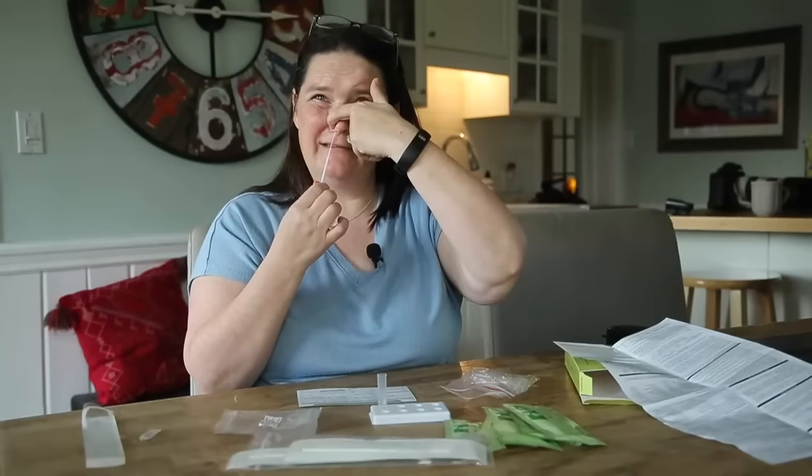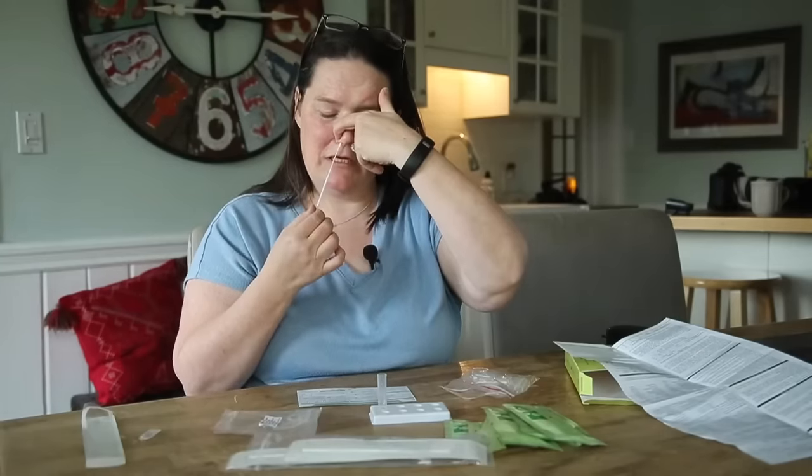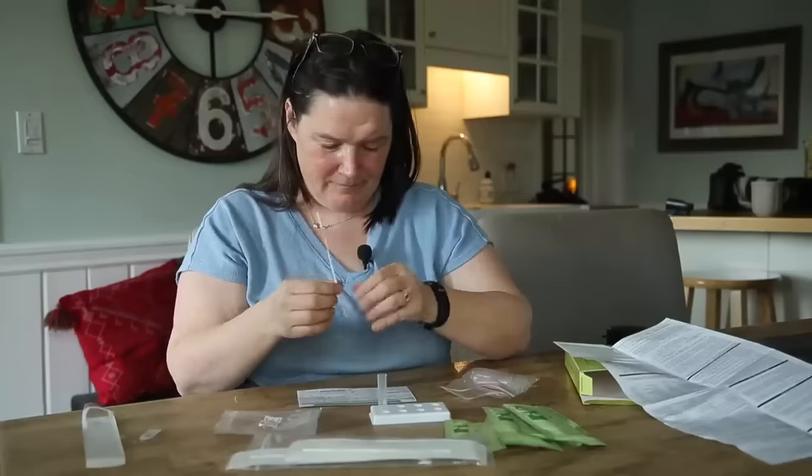So we have to tilt our head back 70 degrees — that's about 70 degrees. Insert until resistance: one, two, three, four, five. Then rotate: one, two, three, four, five. Then pull it out, go in the other side: one, two, three, four, five. Not terribly comfortable. One, two, three, four, five. And take it out. There we go.